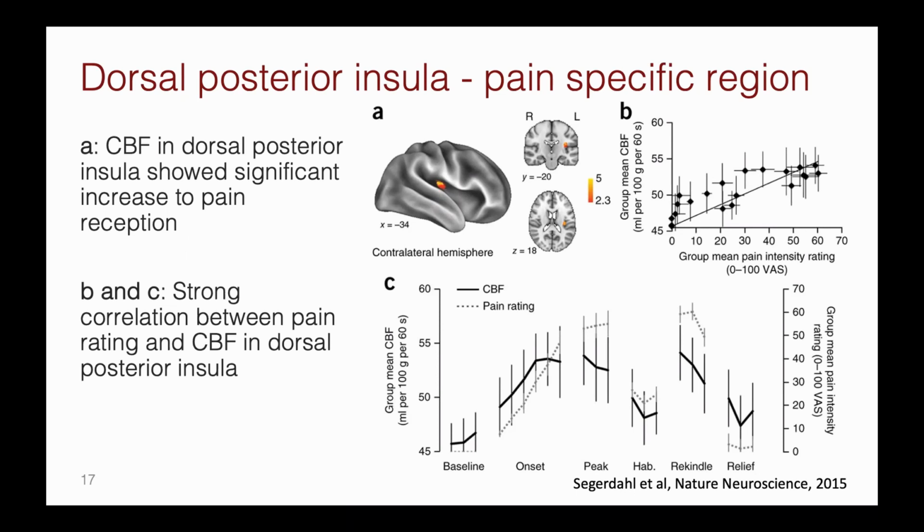Our quantitative analysis also demonstrated a strong correlation between the mean CBF and the pain rating, and a close alignment between the pain intensity and the dynamic change in CBF in the posterior insula.